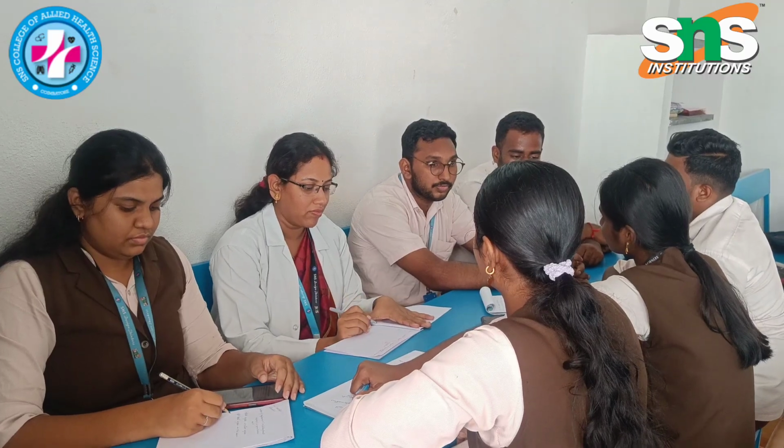Good afternoon, everyone. Today we are going to discuss what things should be maintained by the perfusionist for the retrieval of organs, mainly focusing on lungs and heart. Do you have any idea about the retrieval of organs? Yes, we go as a team and we retrieve the heart or other organs. For the heart, we use cardioplegia solution to arrest the heart and then we bring it back. The retrieval kit procedure follows upon the perfusionist.